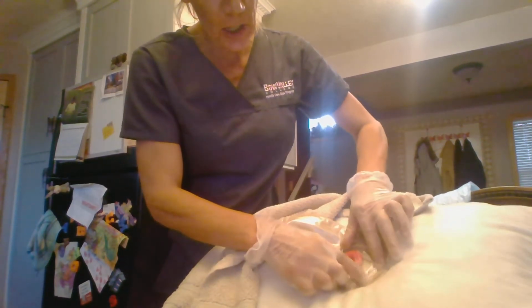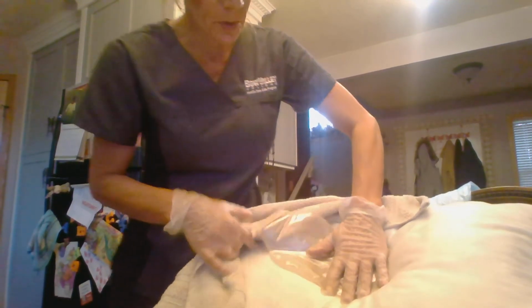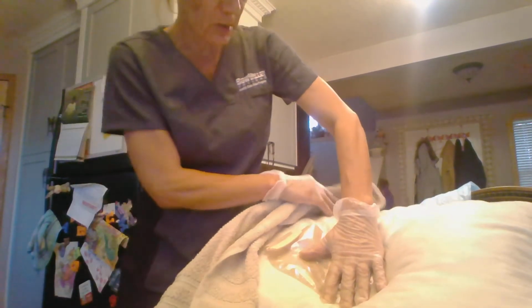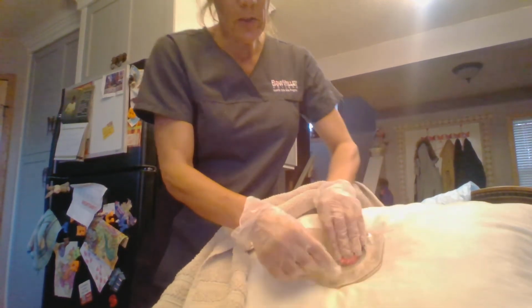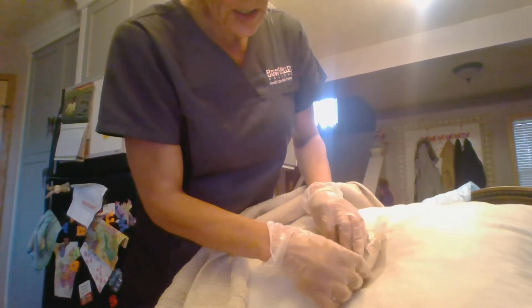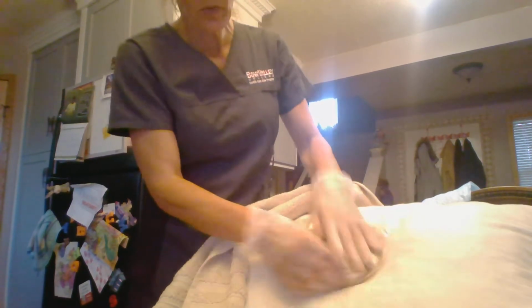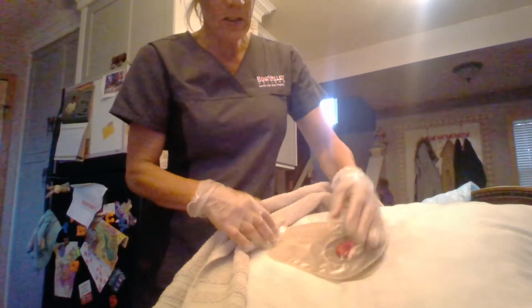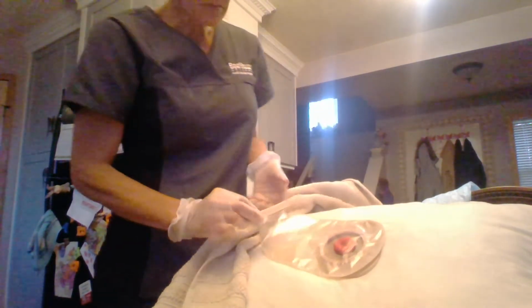And so this slight pressure, once it's in place, you just hold it for whatever the instructions on the system say. And you can test it by just seeing how tight it is. Once it's on, you can actually test it to see if it has adhered itself to the skin.